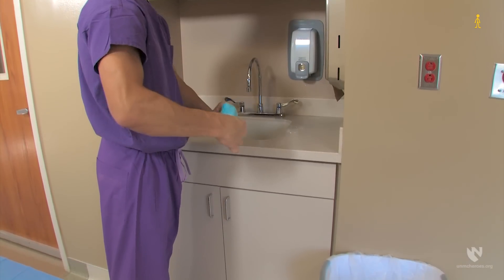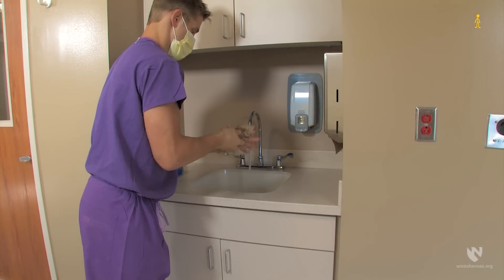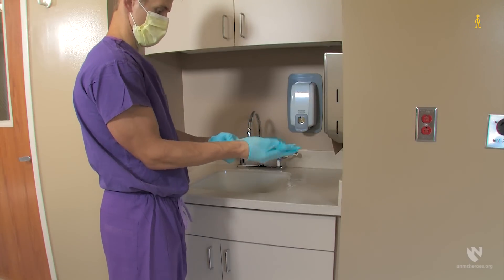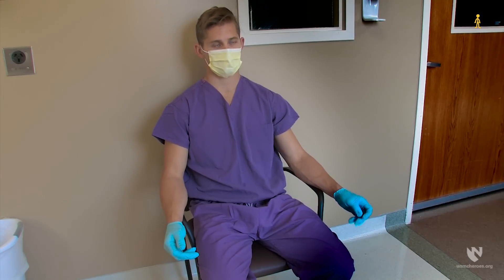The healthcare worker should then proceed to the sink to wash their hands. After hand washing, the healthcare worker should apply a new pair of gloves, then proceed to the shower. If the shower is currently occupied, the healthcare worker should sit in the designated waiting area until the shower becomes available. The gloves and patient care mask will reduce any inadvertent hand-to-face actions. After the healthcare worker has showered, they shall take their temperature and rehydrate.